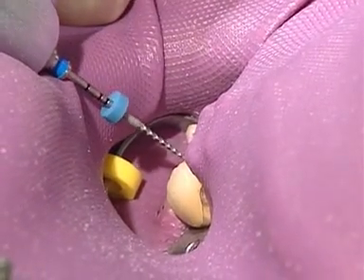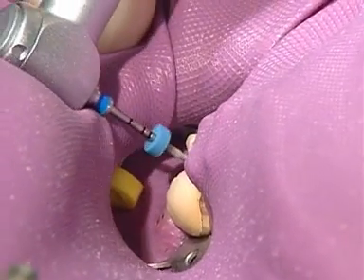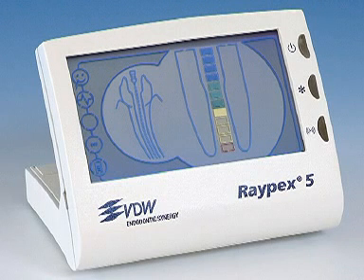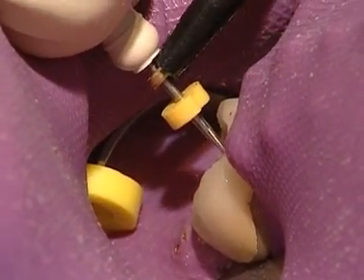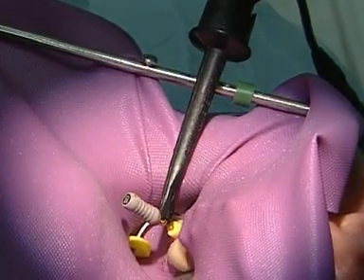Up until now, the stoppers had been set to an approximate canal length based on an X-ray image. When 2/3 of the estimated working length has been reached, exact canal length should be determined. For this, an electronic instrument like the Rapex 5 is almost indispensable. Rapex is more accurate than an X-ray, and because of this, it is not necessary to take an X-ray at this point.